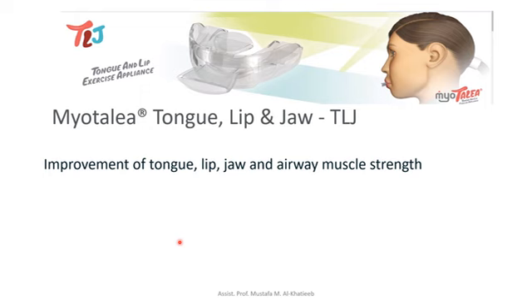It is an active oral myofunctional appliance. This is the tube. Air spring.